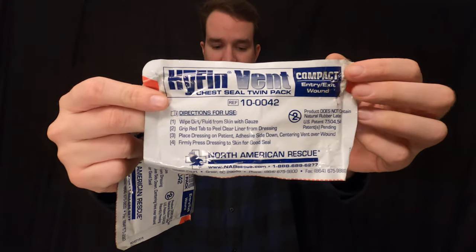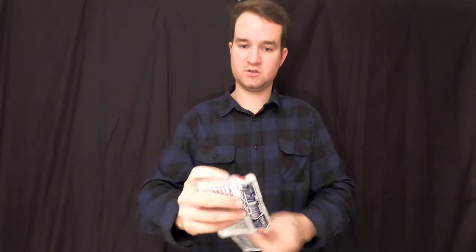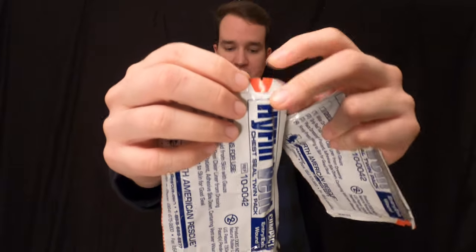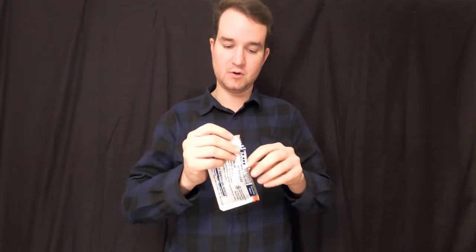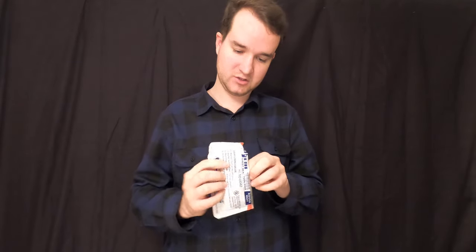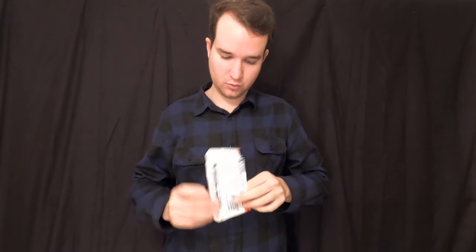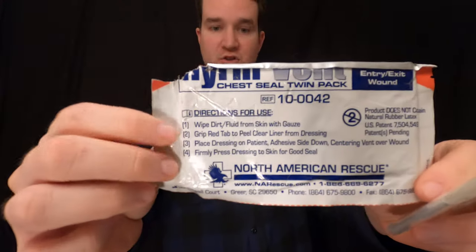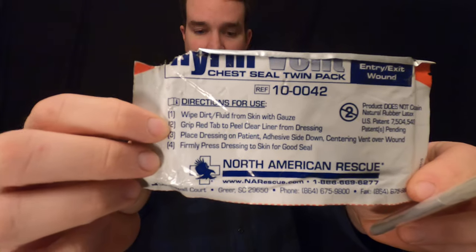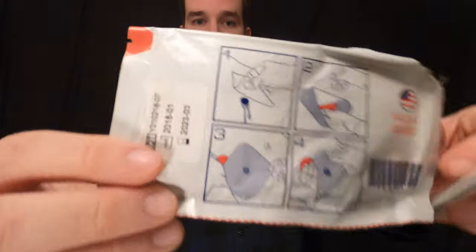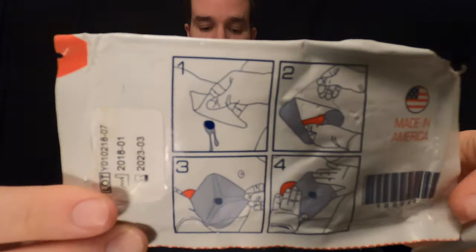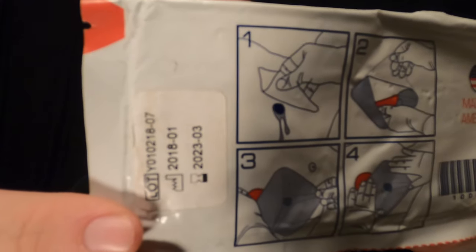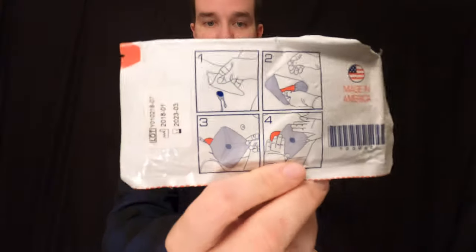And what we're gonna do with this twin pack is we're gonna open one up. You can see it just has little cuts right there. So you can just rip it open. And once you rip it open, you're gonna pull out the chest seal. Now, what's really cool is actually the directions on the Hyphen Vents packaging. On the back, it actually has pictures of showing it. So you have words on the front and pictures on the back of how you can do it.